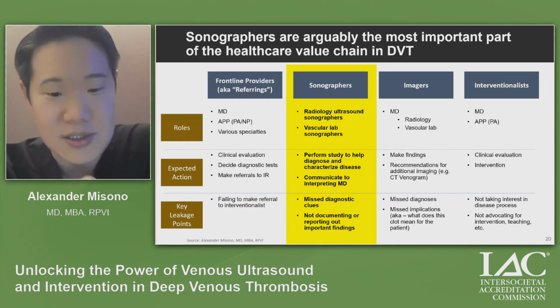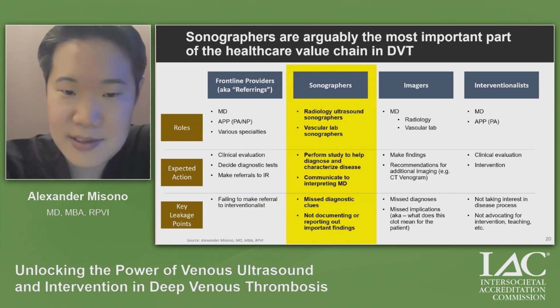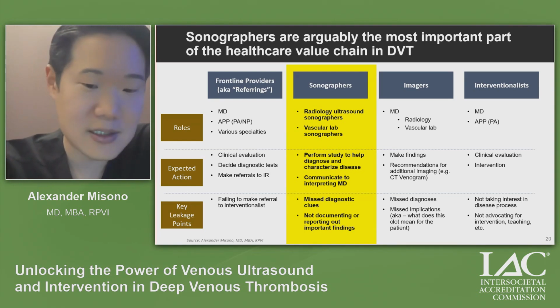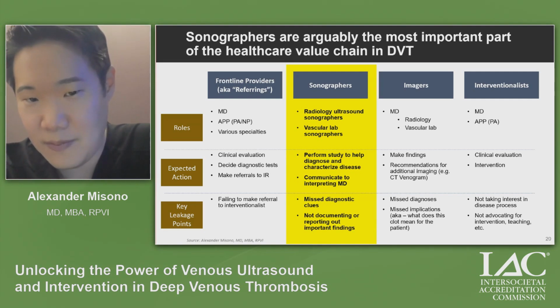And if you have questions, for instance, diagnostic clues, don't miss that question by moving on, but instead raise it as a possible issue. If there is something important, always document, report out, and communicate, as opposed to maybe burying it somewhere in the body of your preliminary report.